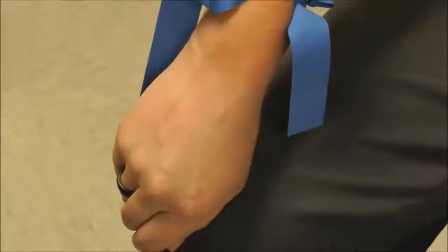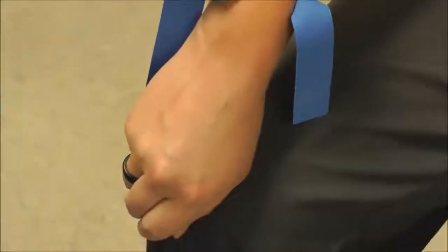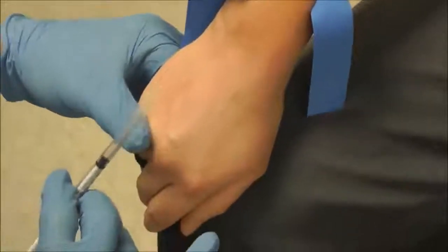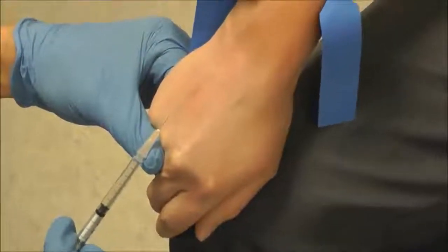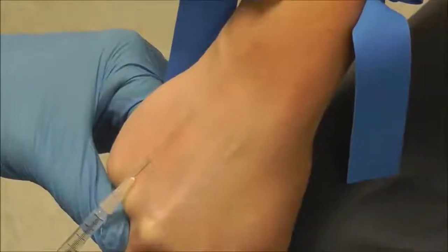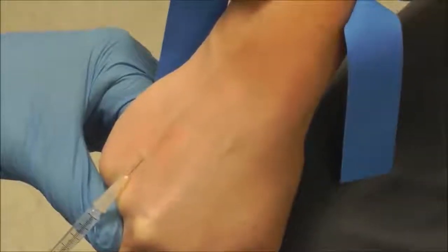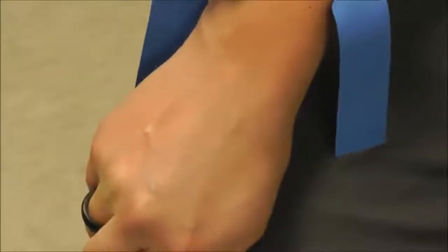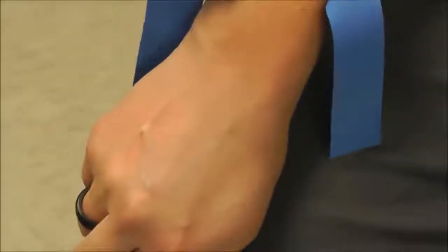Next thing is lidocaine. This is just a 30-gauge needle. If you're good at this, you won't even feel it. The effective way to use lidocaine is just to go right underneath the skin. You see how that little skin wheal is popping up there? That's effective lidocaine. Did that burn? No. See, you didn't even feel it because we just went right underneath the skin.